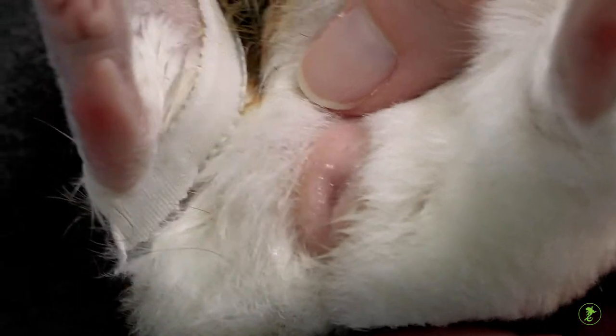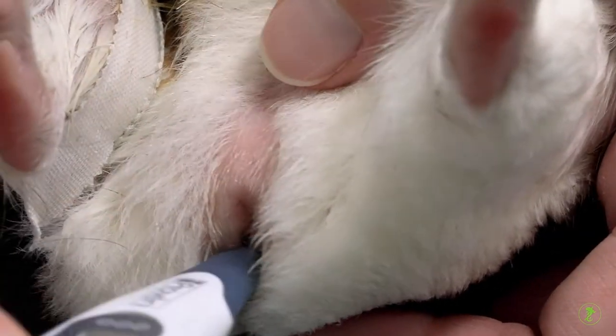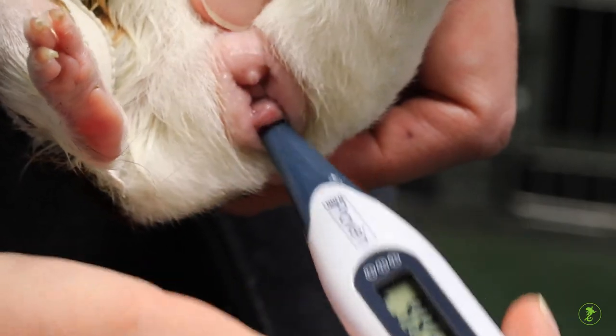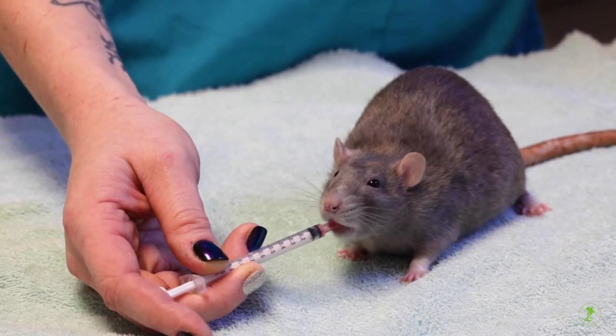Due to the unique anatomy of the rectum of the guinea pig, taking temperatures is often challenging and should be done only after considerable practice under the instruction of the veterinarian or veterinary nurse. Taking temperatures may also be possible in larger rats.